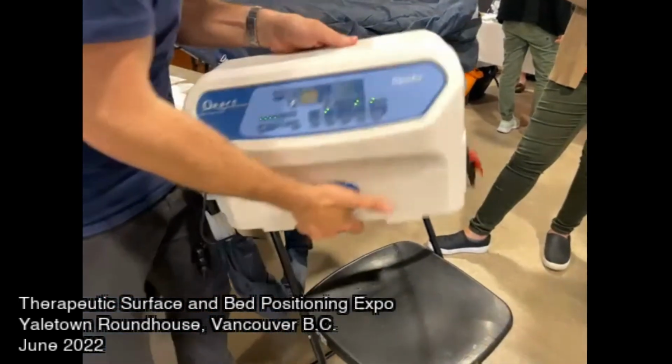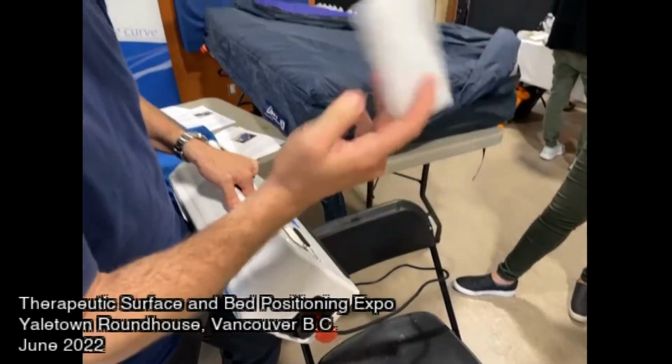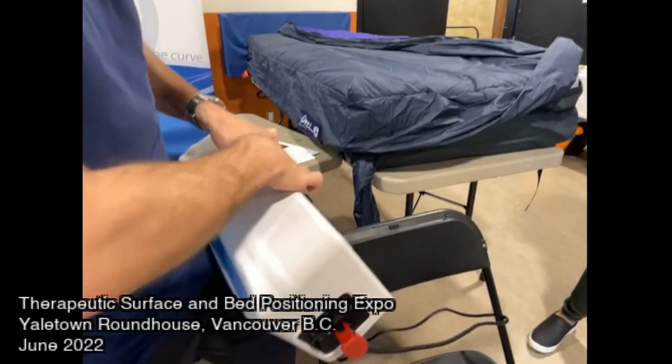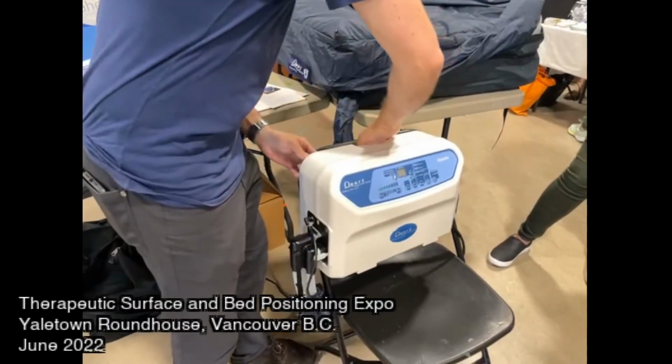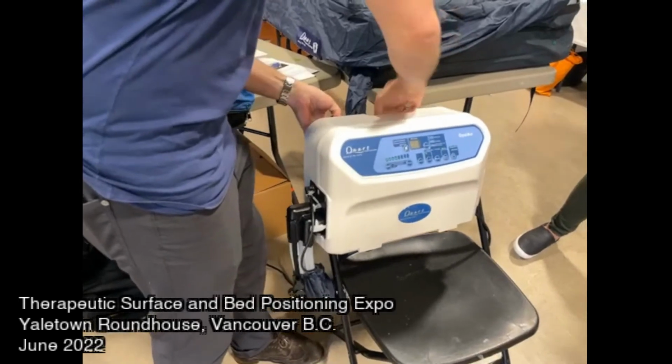In terms of maintenance, all you have to do is take this out about once every 6 months. You can rinse it under warm water and then you just pop it back in. That's the only maintenance that's required. And if they're in a private home, you'll easily get 5-6 years without there being any need to do anything.